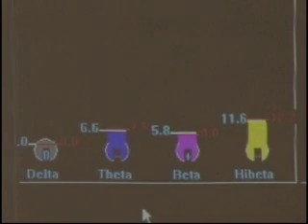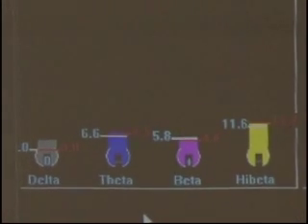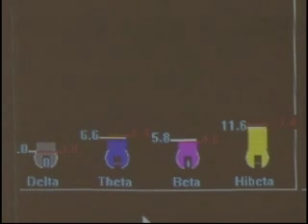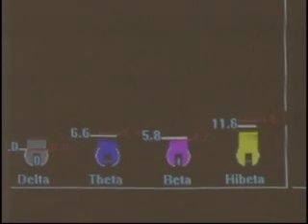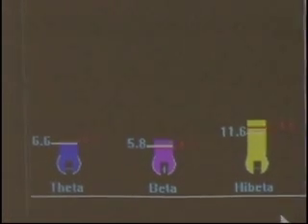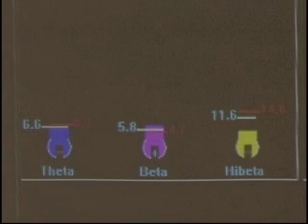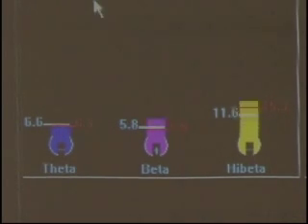If it's a stop, you want the wave inside the lines; if it's a go, you want it outside. The only one you don't want touching the lines is the rejection band — anytime it touches, it turns pink and removes that sample. Let's look at the thermometers. I'll turn Delta off since we're not looking at it, so we see Theta, Beta, and High Beta frequency bands.